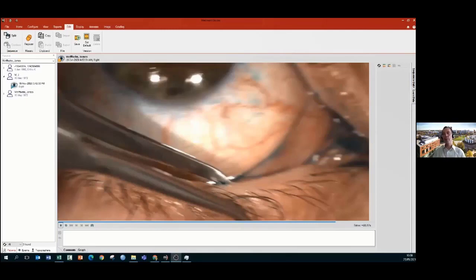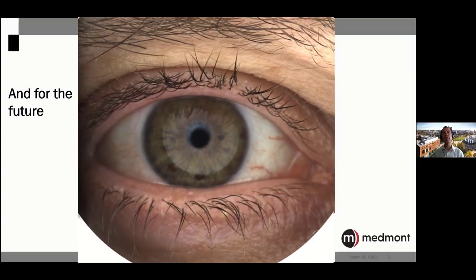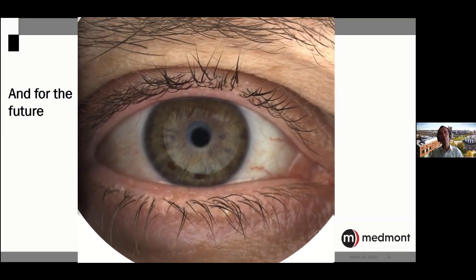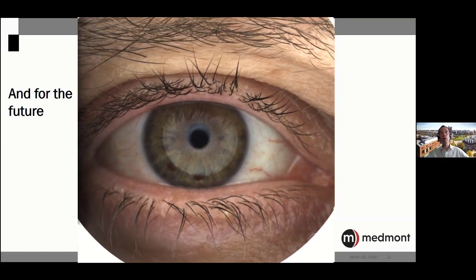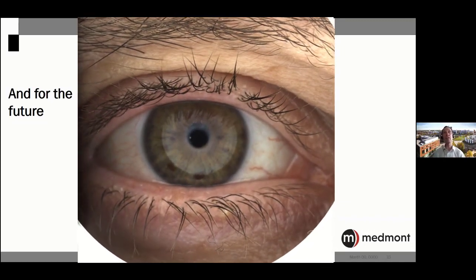Now, I mentioned interferometry. This is something that Medmont are working on to add to their instrument, and hopefully this will give you an insight. So this is actually taken with the Meridia. What we've done is put an insert into the front of it that we're working on. And you can very clearly see the oils there. I've given you the large picture. Obviously, we can zoom in on the eye in isolation.